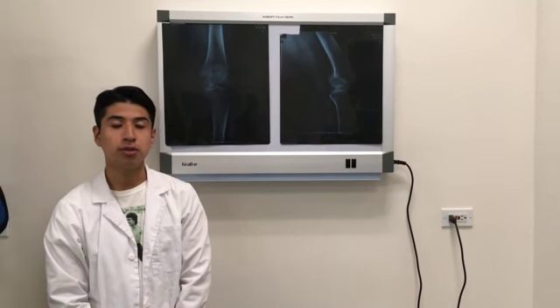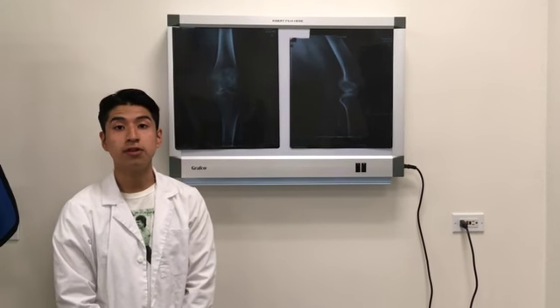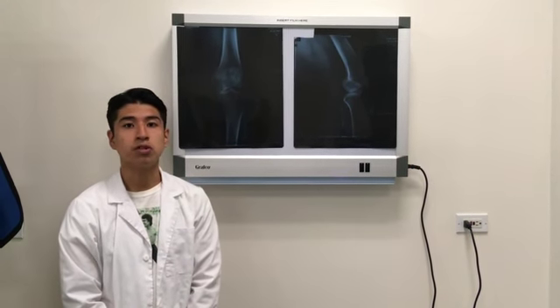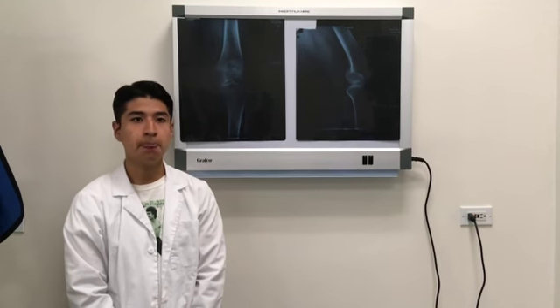The special case that I'm going to be showing you today comes from NYPQ. The patient that I had was a 52-year-old female patient who was coming in for an x-ray of her left knee because the following day she was going in for surgery.